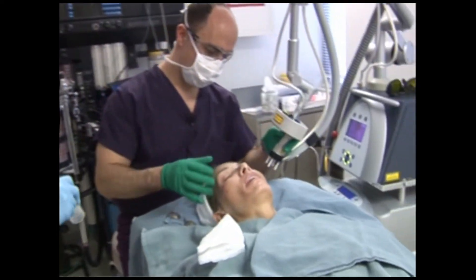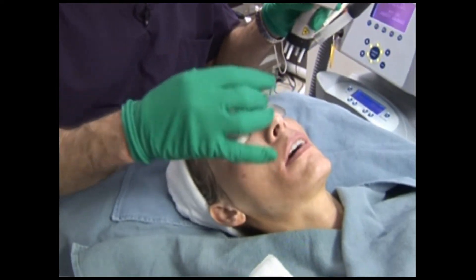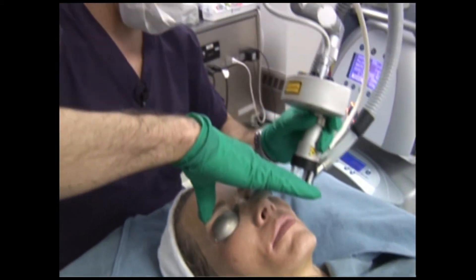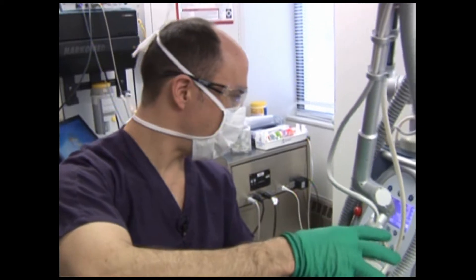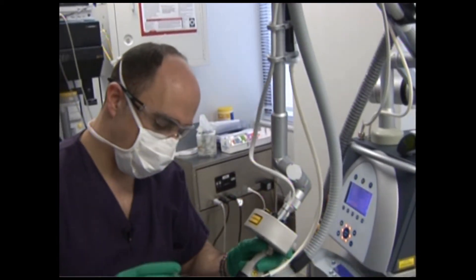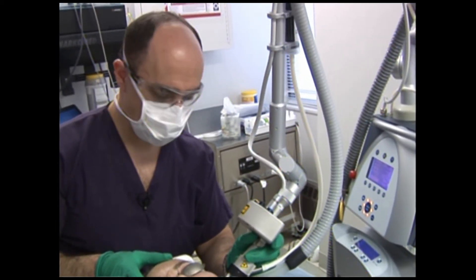There's the cold. I'm going to put these shields on your eyes and keep your eyelids closed. If at any time you're worried that the eyes aren't well protected, just let me know. I'll do the first pass on your cheek. Christine, I'm going to have you turn your head this way, wherever you're comfortable.